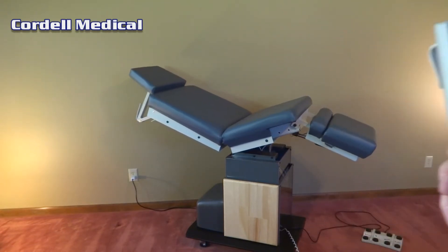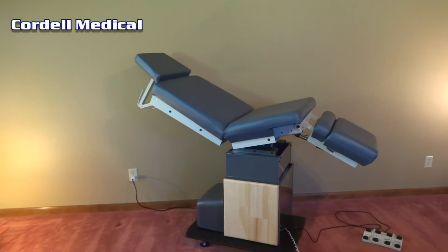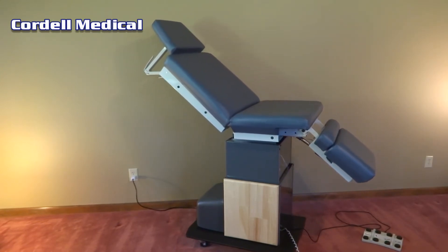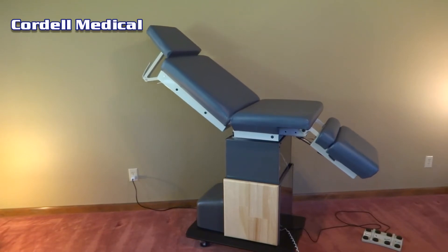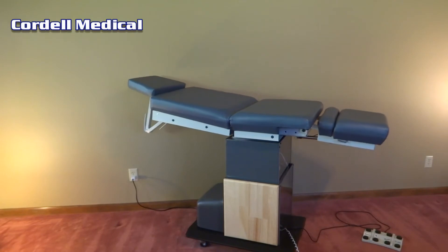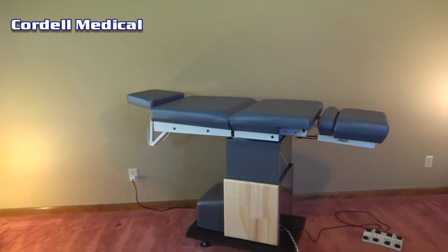These tables are retrofitted for easy operation and maintenance. The smooth and quiet actuators are controlled by a hand control with up to three programmable settings. Also included is a manual foot control for hands-free operation.